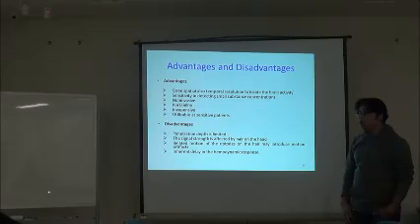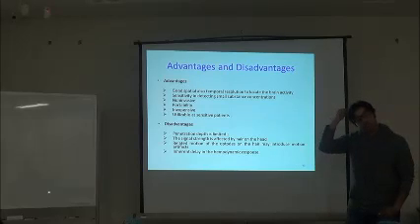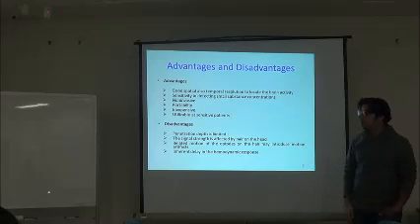Number 3 is the motion artifact. The relative motion of the optodes on the hair may introduce motion artifacts. So if the optodes are moved because of movement of the head, there could be motion artifacts.